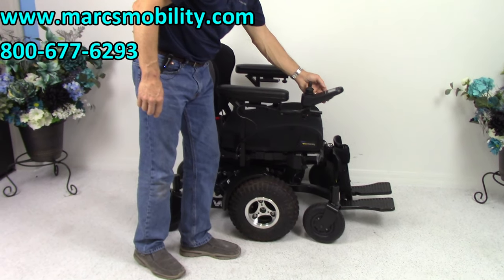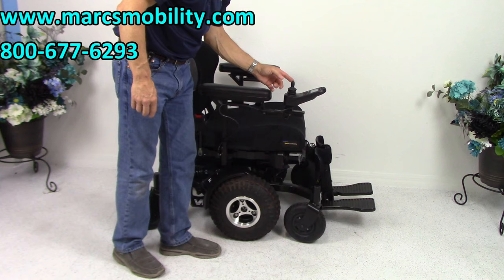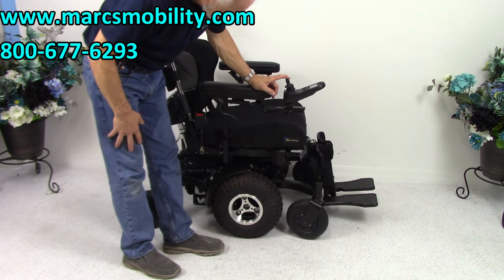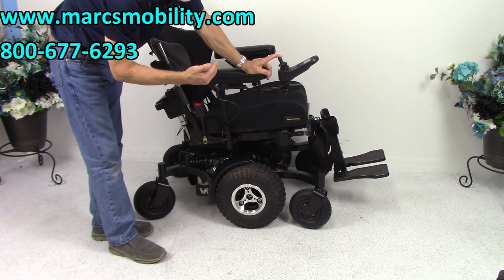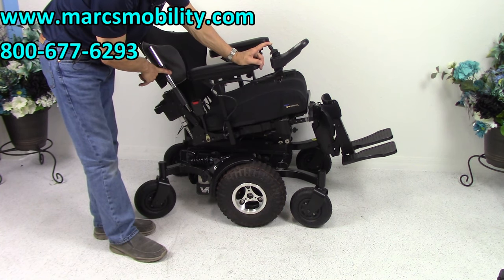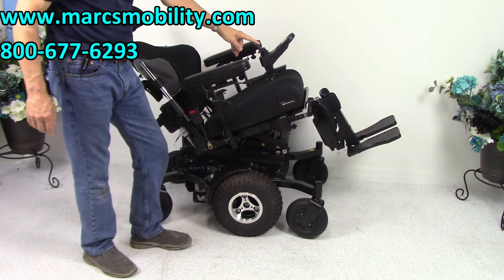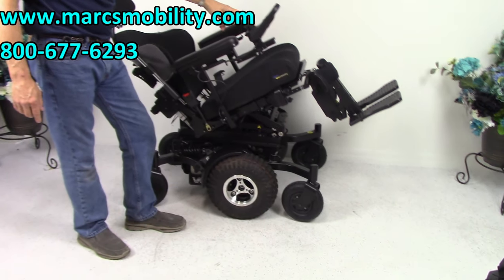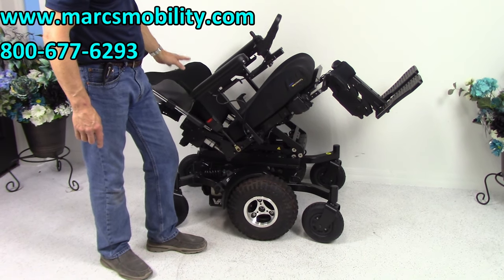The second option is called the electric tilt. The electric tilt moves the whole base — the seat base goes back, taking the legs and the back with it. That's the electric tilt going back right now. Let's see how far it'll go — okay, that's as far as it'll go.